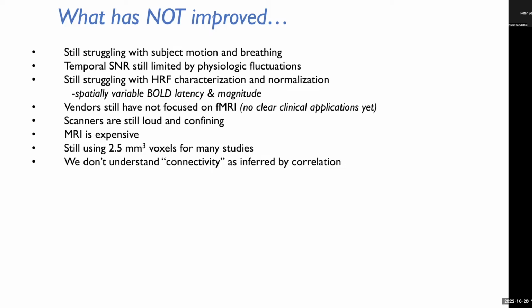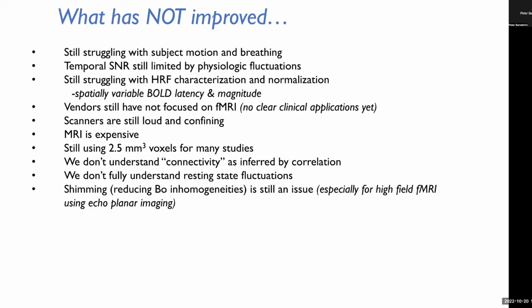There's a lot of things that can modulate correlation and have nothing to do with connectivity. And we don't really fully understand resting state fluctuations. We don't know their purpose. We don't know how much is conscious, how much is unconscious. We still don't have our heads around that yet.